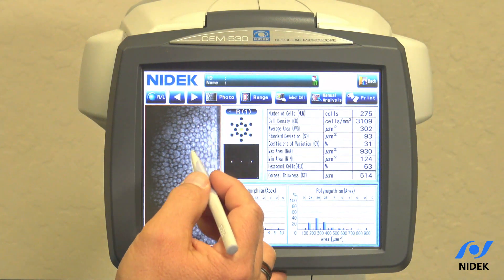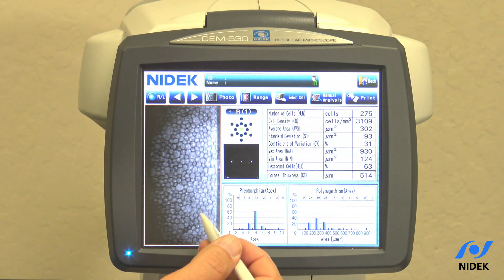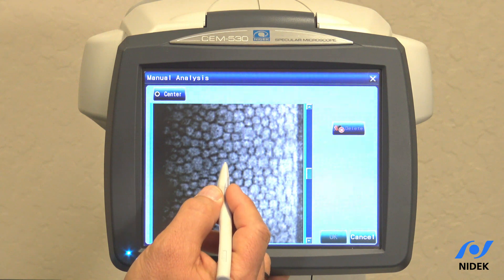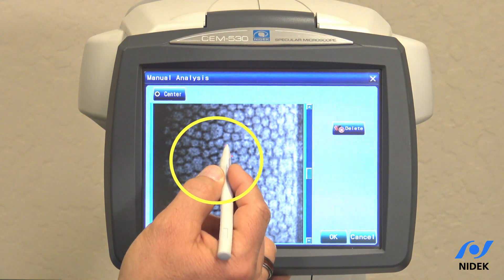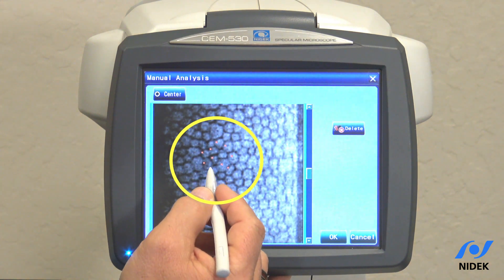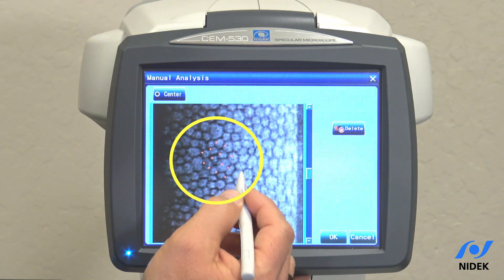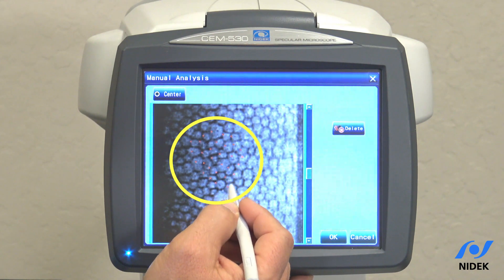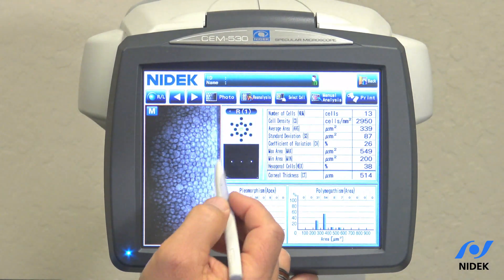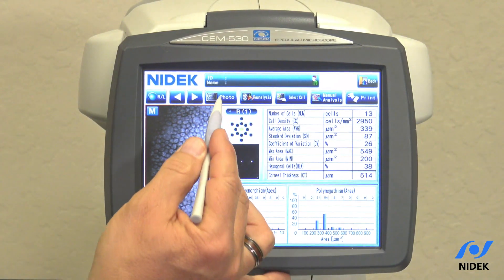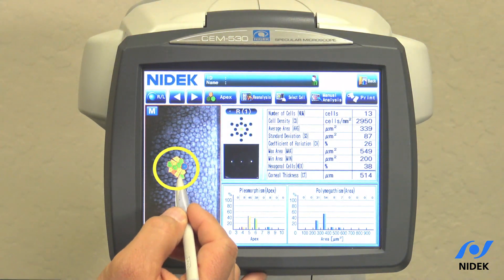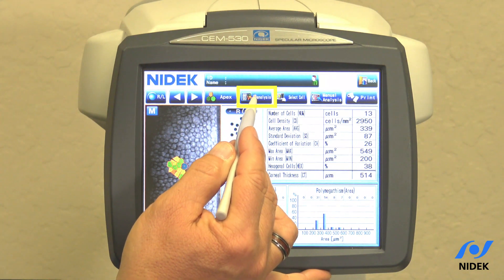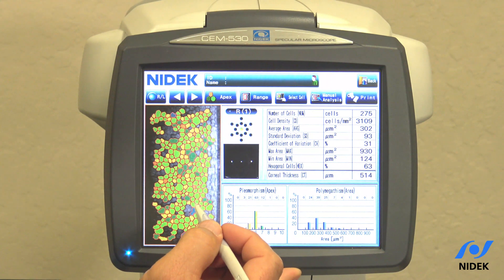If you're not happy with the auto-analyzed results, or if automatic analysis cannot be obtained, we can go into manual analysis. In manual analysis, we utilize the center point mode, which means you have to select the center of each cell. The software will not analyze a cell until it is completely surrounded. Once you have a minimum of 10 cells that are completely surrounded by center point counted cells, you can go into the OK tab. I now have 13 cells counted. In the Apex view, you can see where I counted the cells. If you want to return to automatic analysis, select reanalysis.